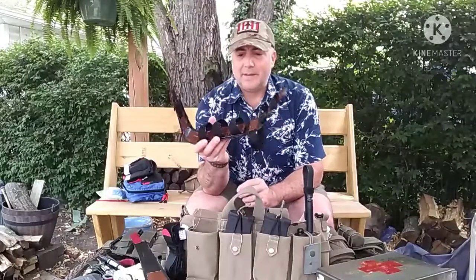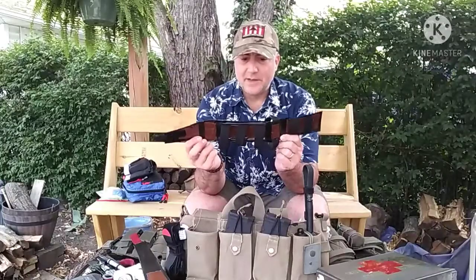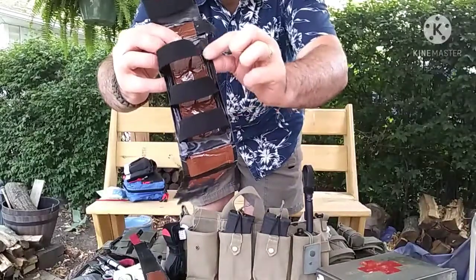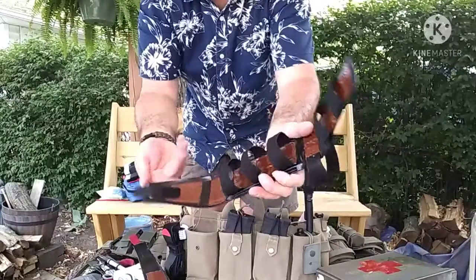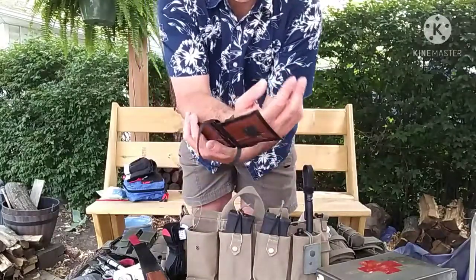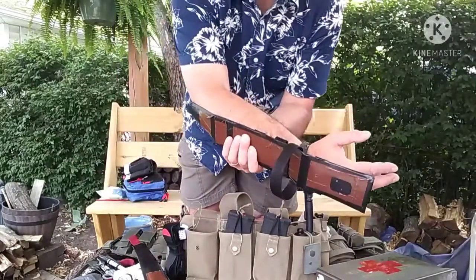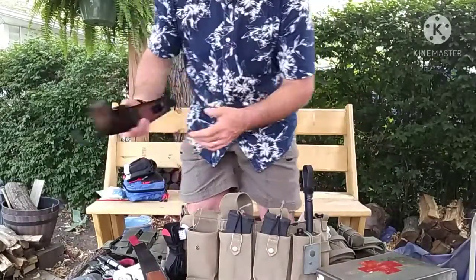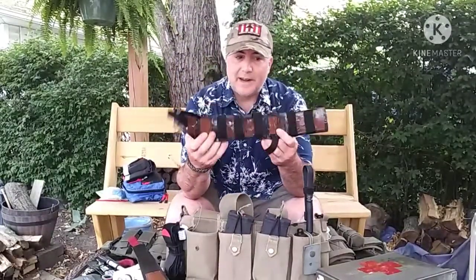But something that I like about this setup, copying off of that trauma insert, is the way that I made mine: the centerpiece here in the middle, I put a wire stiffener down both sides. That way this can be used as a SAM splint if you needed it to. You can use that with your ACE bandage or your tape or your rolled gauze to secure it to a broken arm, broken wrist, broken leg. This is your built-in pseudo SAM splint for taking care of those things.